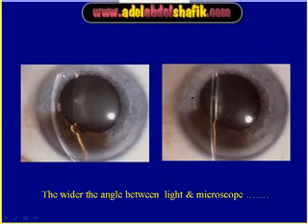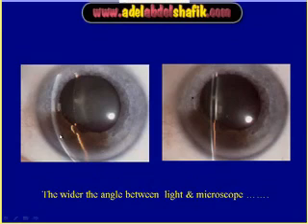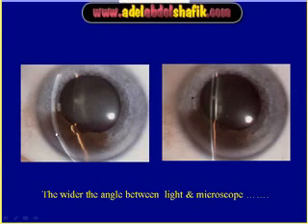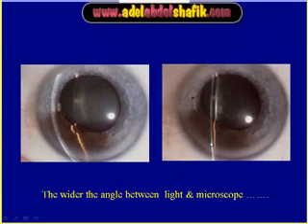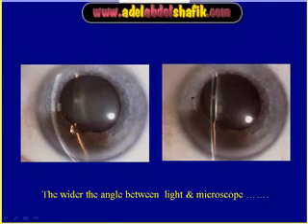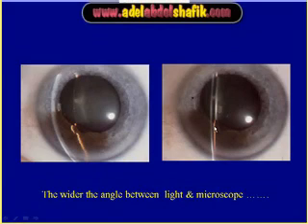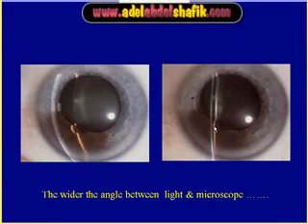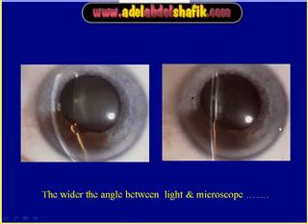In this example, you can see a section in the cornea — light is coming at an angle, so the section is widened and you can see more details. When the light is end-on, the cornea looks very thin. As you notice, there are some elevations on the surface of the iris not visible in that view. So keep in mind to always bring the light from an angle, preferably a wide angle — this will give you better information.